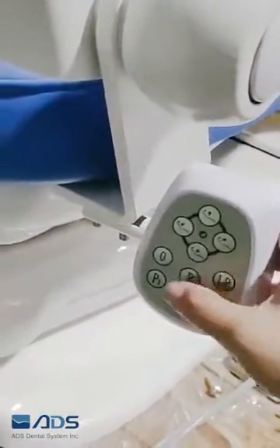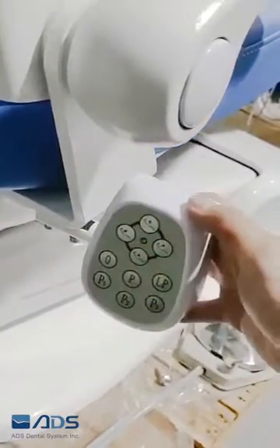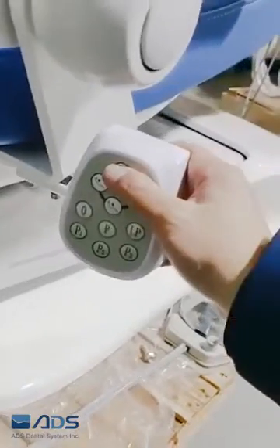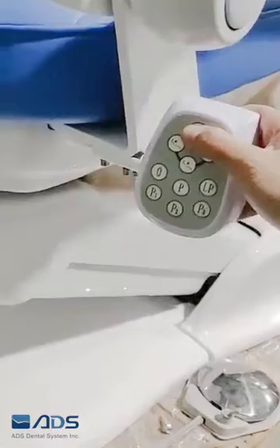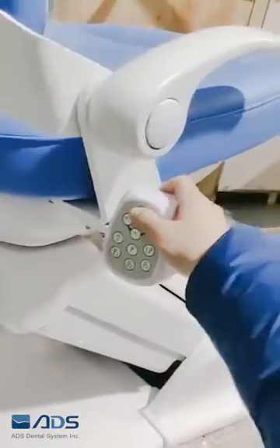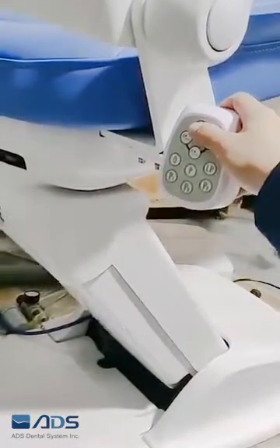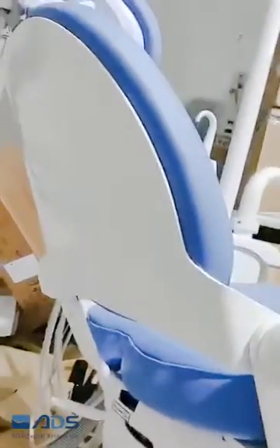Then press the zero button. After that, put the chair up to its limit, then put the backrest down to its limit.